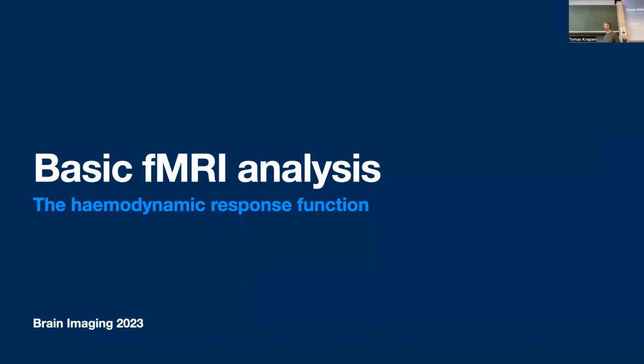And then the question is, how do we use the fMRI machine to get some sample of that? Well, this is an inherently ambiguous thing. There's a lot of distance between the BOLD response that we measure and the neural firing that we are interested in. So this is one of those caveats.